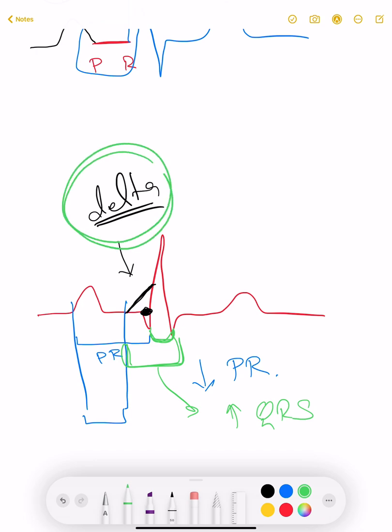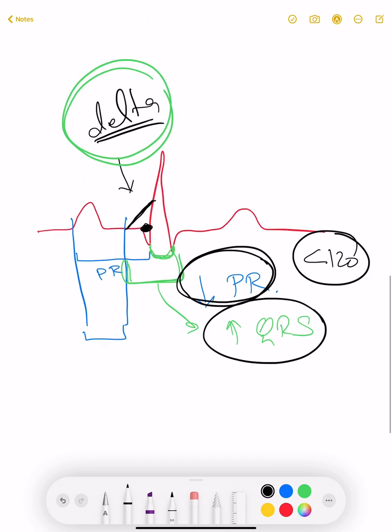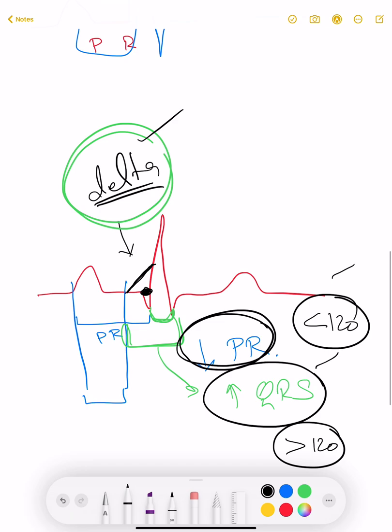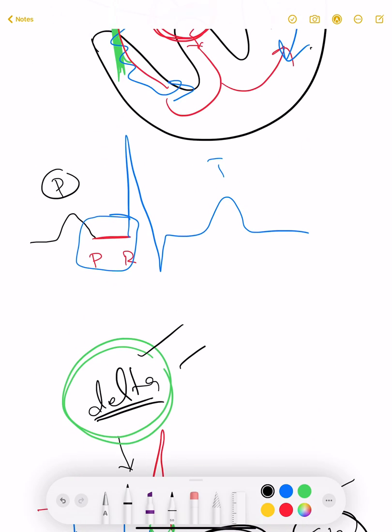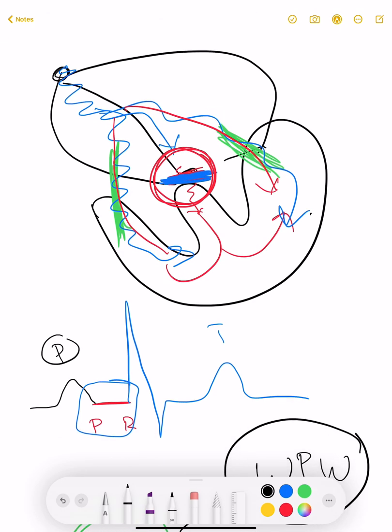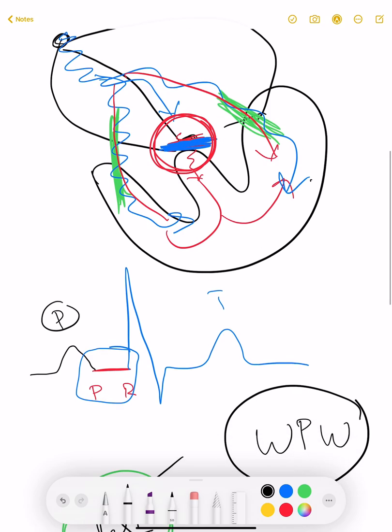So what are the three striking features of WPW syndrome or any pre-excitation syndrome? First, decreased PR interval — meaning less than 120 milliseconds. Second, increased QRS complex duration — more than 120 milliseconds or more than three small squares. Third, formation of a delta wave. If we have these three features in our ECG, we call it a pre-excitation syndrome. The most common and famous one is WPW syndrome — Wolf-Parkinson-White syndrome. There is an extra pathway that bypasses normal AV nodal conduction, causing early upslurring, short PR, prolonged QRS, and a delta wave.